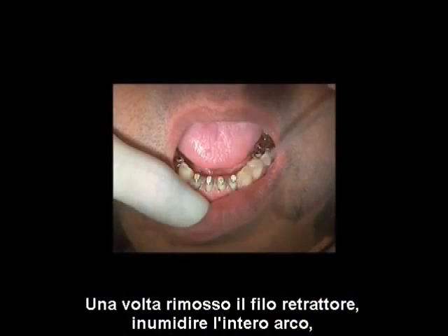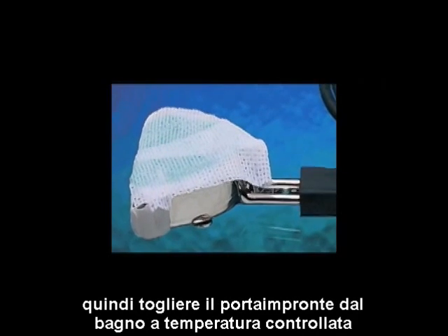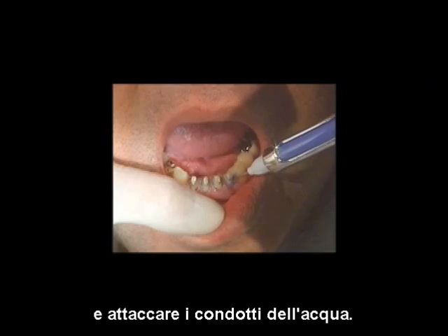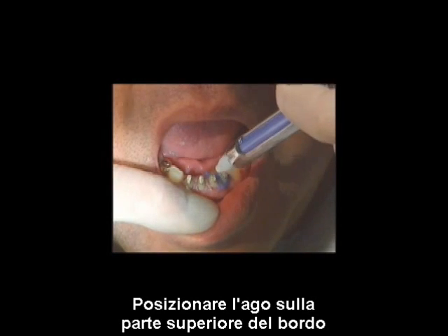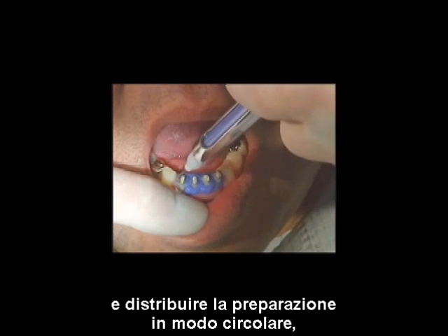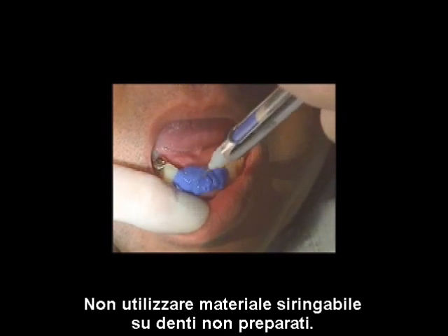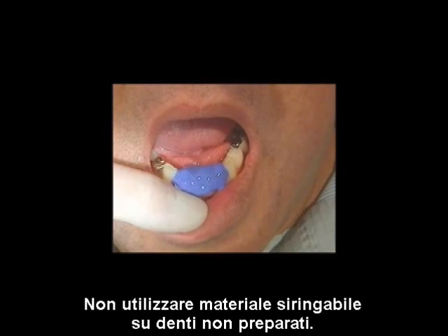Once the retraction cord is removed, wet the entire arch with PrepWet. Remove the tray from the tempering bath and attach the water-cooled tubing. Position the needle at the top of the sulcus, filling it and surrounding the preparation. Next, cover the entire coronal surface. Do not use syringe material on non-prepared teeth.